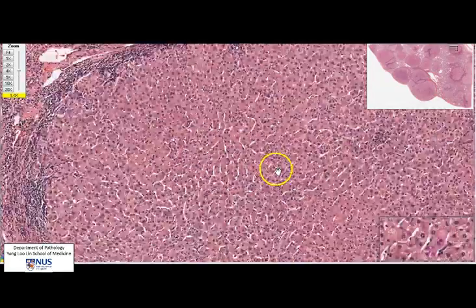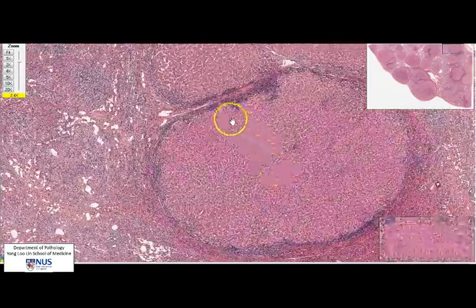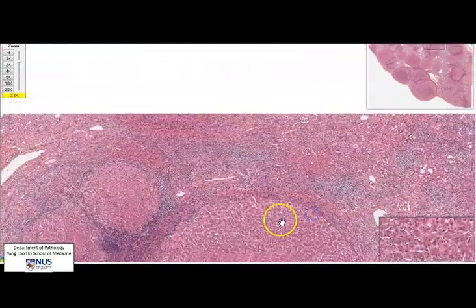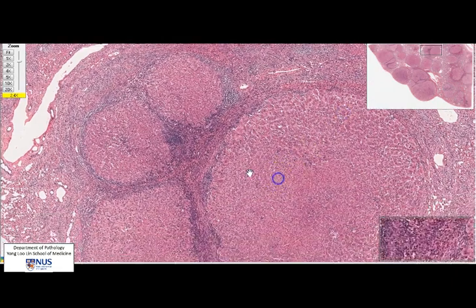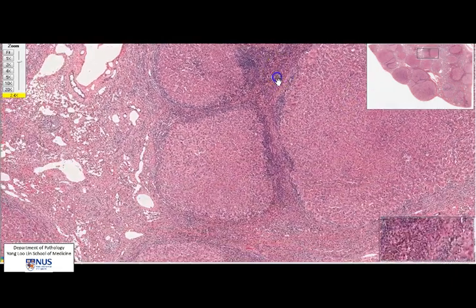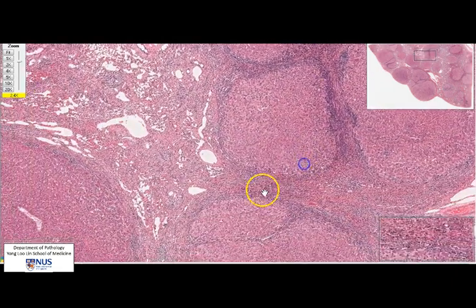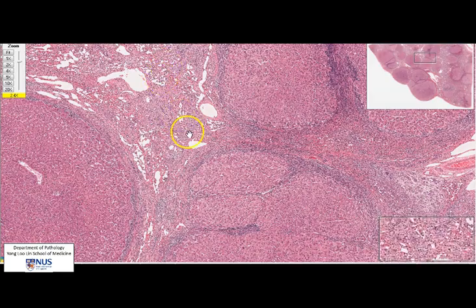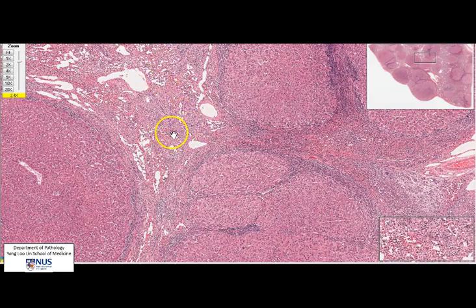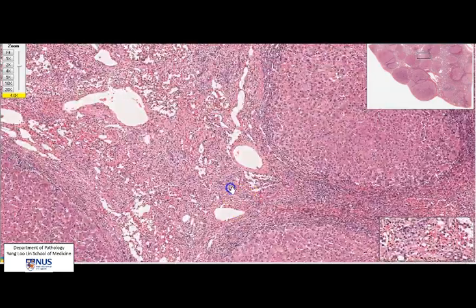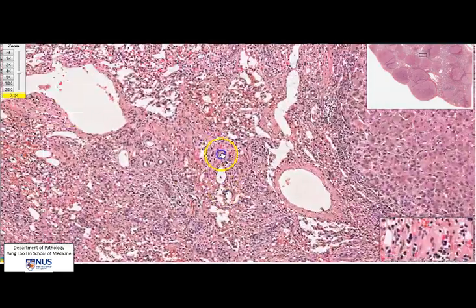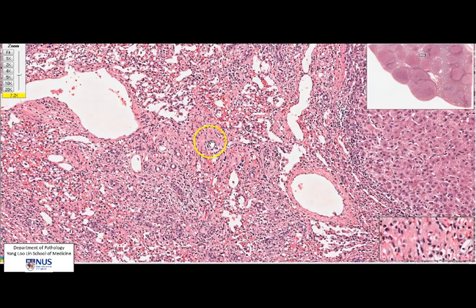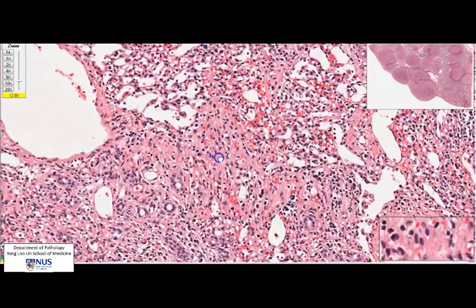Let's zoom back out and look at the intervening area between nodules. We can see that this area is fairly pink, and the pinkness is due to fibrosis — collagen and fibrous tissue here.